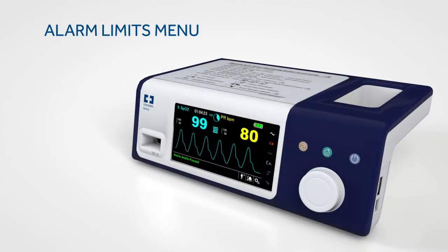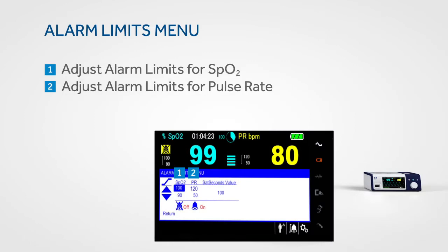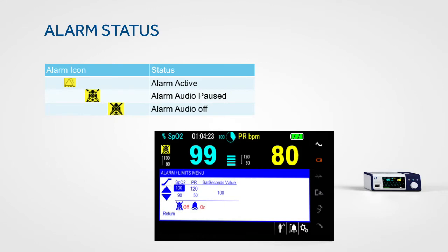To access the alarm limits menu, rotate the jog dial to highlight the alarm limits display area and press. From this menu you can adjust the alarm limits for SpO2, pulse rate, and sat seconds. The alarm limits menu also allows you to silence audible alarms until the next power cycle. Colour icons show you alarm status at a glance.